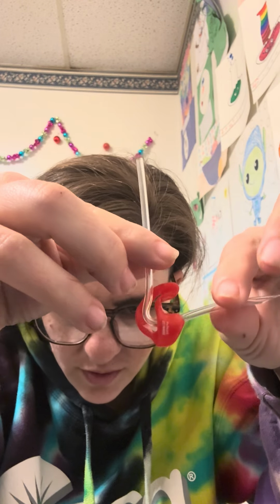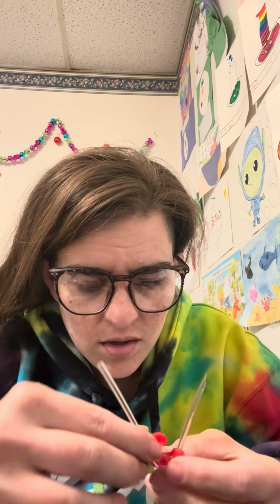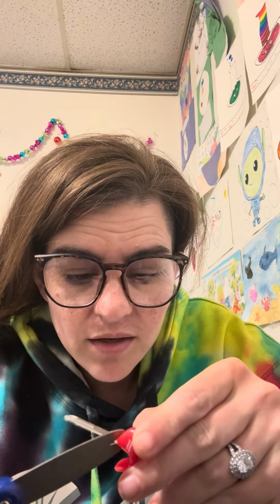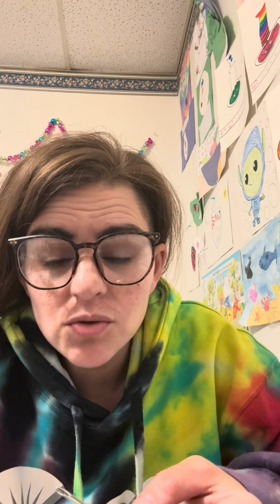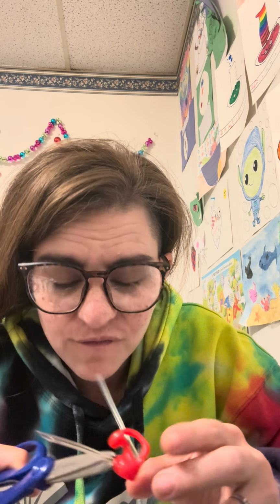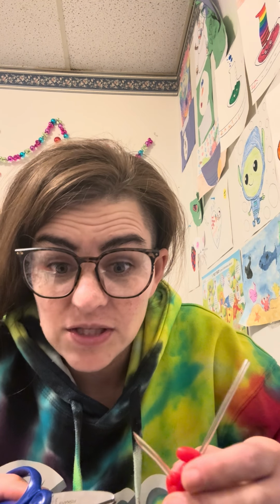See that? Okay. Now all of this can be cut off. Now you want to be very, very careful not to cut your mold, okay? So you want to stick this like this and just cut it at the very end. You can always trim it a little more. You can use nose hair scissors or nail clippers. The really tiny nail clippers work really well. If you don't cut it flush enough, then the little edge will be scratching you inside your ear, and that's no fun.